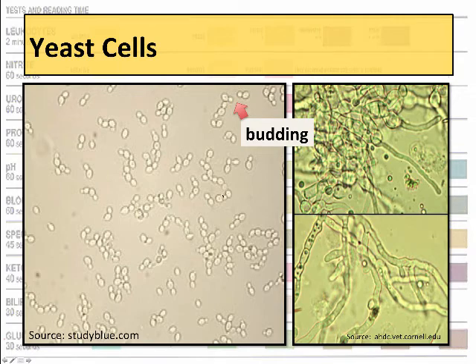And that's obviously a sign of a yeast infection. In women, Candida albicans is very common to get. Diabetics also tend to have yeast infections more often or higher yeast concentrations in the urine because their urine is very acidic and yeast likes to live in acidic urine. Also, it tends to have high levels of glucose, which means that the yeast could live there and feed. So it's not uncommon to see it. You shouldn't have any yeast in the urine. Normal is negative, but it's common that that happens.